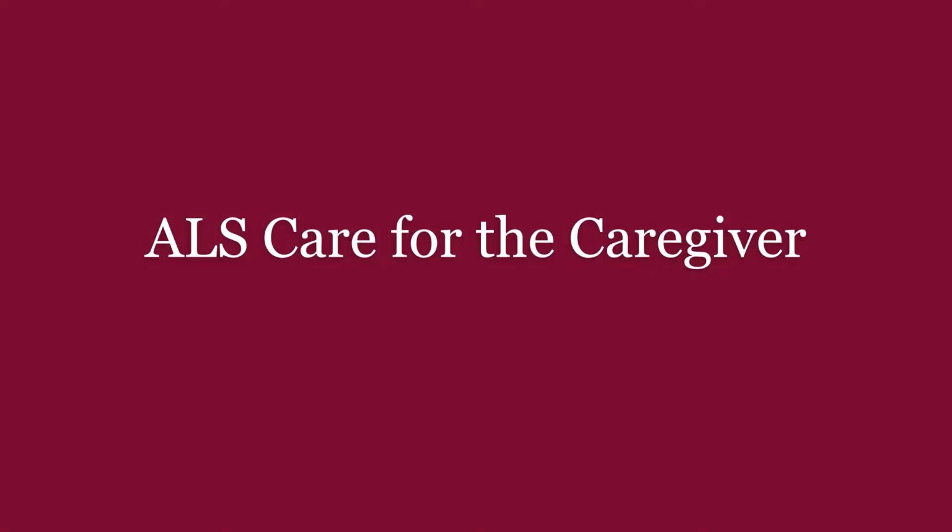Welcome to the ALS Care for the Caregivers Episode 3. In this episode, we'll be discussing toilet transfers with the use of the sit-to-stand machine, as well as a pivot disc squat transfer, as well as a transfer to and from the tub using a squat pivot technique, and Hoyer transfers to and from a bed.